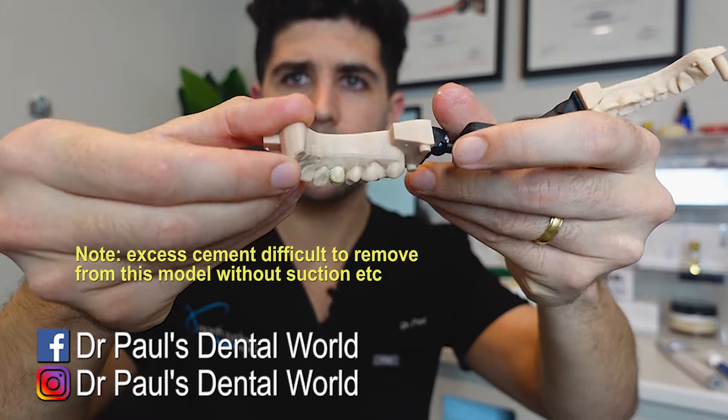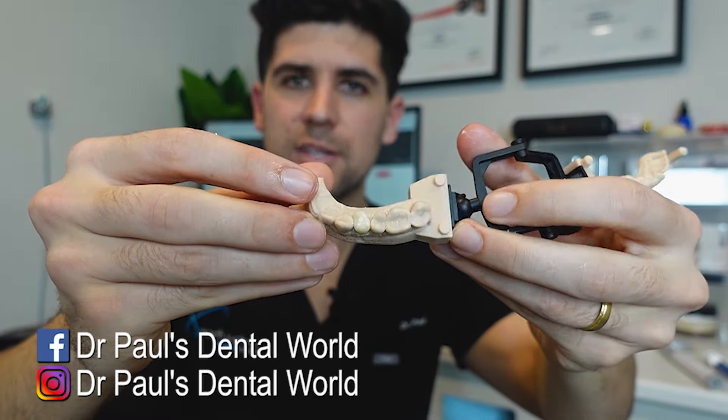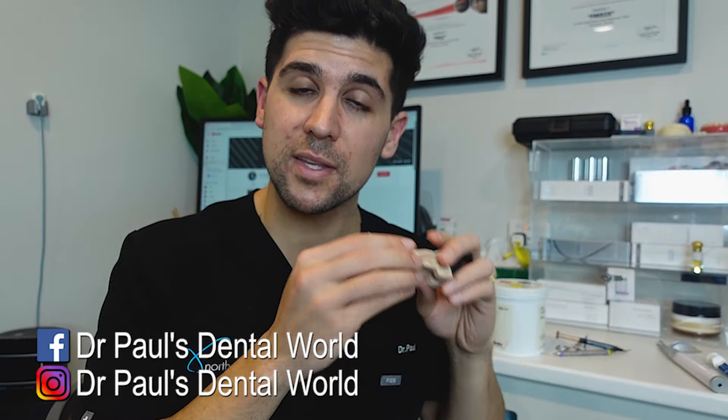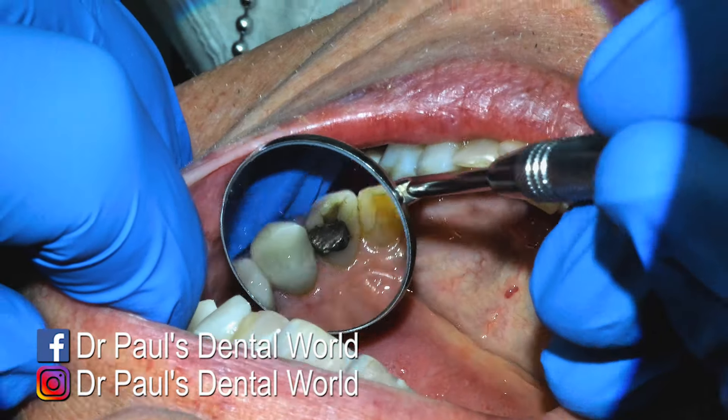And that is how it looks. So after removing the excess, I'll then check the occlusion, make any adjustments that we need to, and then we're good to go. So now I'm going to show you the exact same thing, but on a real life patient. So this is the tooth that we're working on — it's the upper left canine.